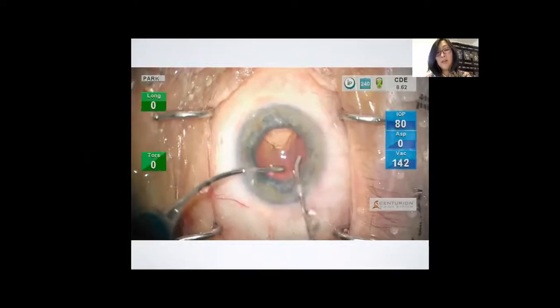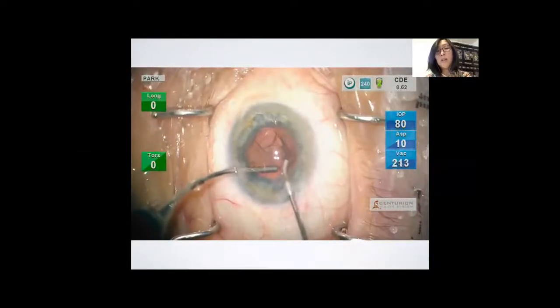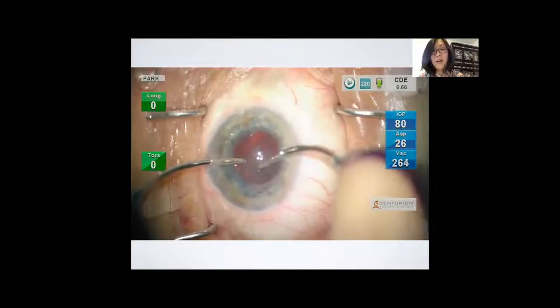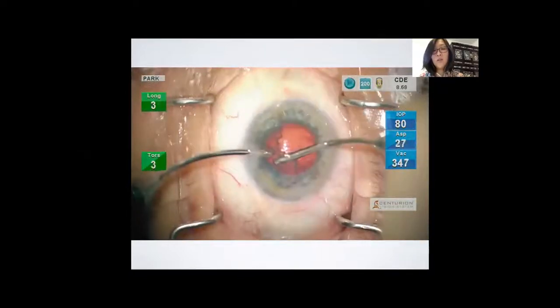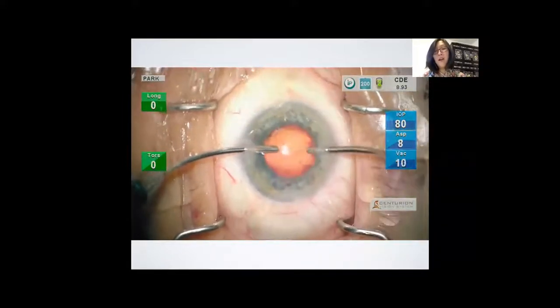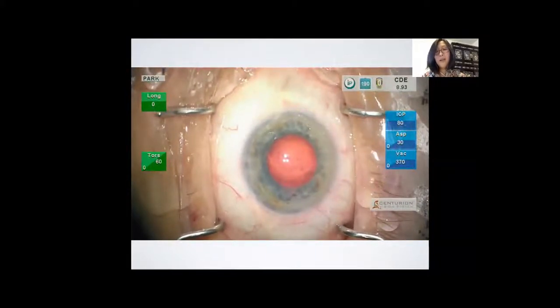And you can see in this particular case that it looks like there's a central opening there, but I've walled it off in order to carefully remove the material that's on top of it. And I'm using those small molecular weight chains in order to fill this space. What's nice about this is it actually turns out there was no rupture in the back, but I've filled with those small molecular chains in order to protect that area and perform the rest of the removal safely.